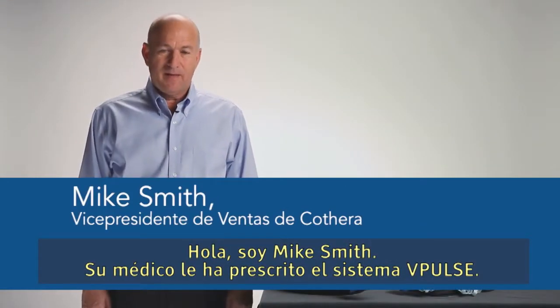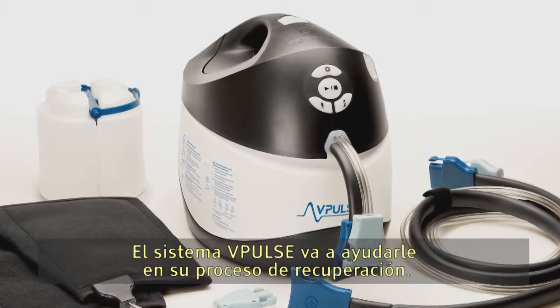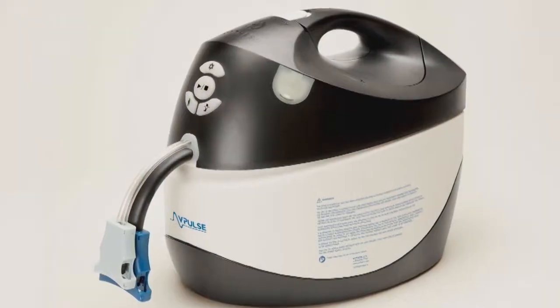Hi, my name is Mike Smith. Your doctor has prescribed for you the V-Pulse system. The V-Pulse system is going to help you in your recovery process. This video is going to help explain how that's going to work.